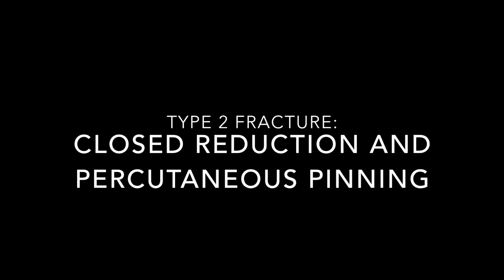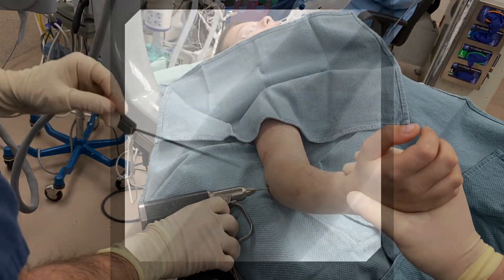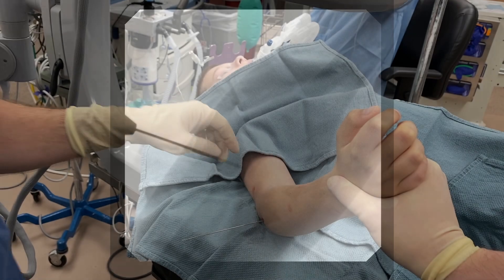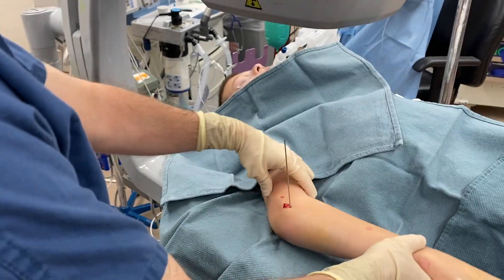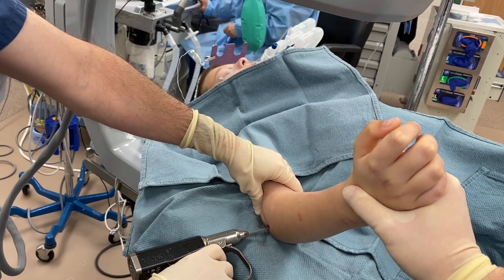The child was therefore indicated for a closed reduction and percutaneous pinning. First, a 0.062-inch K-wire is placed transversely across the joint line to prevent any further displacement. Multiple fluoroscopic views are obtained as the wire is advanced to confirm placement and reduction.